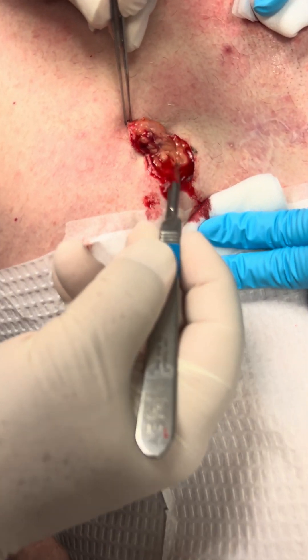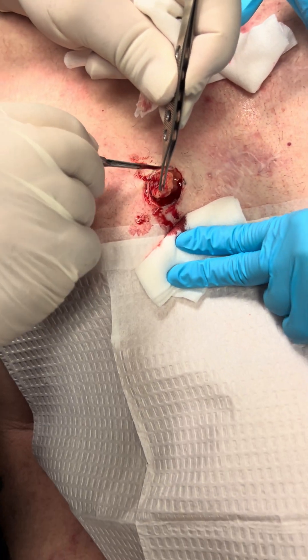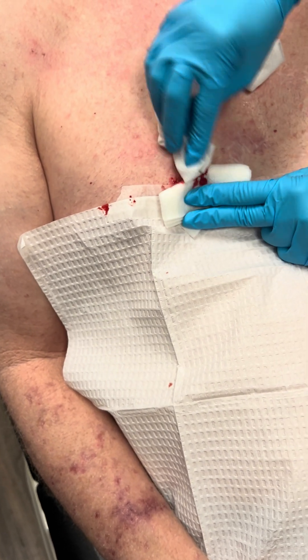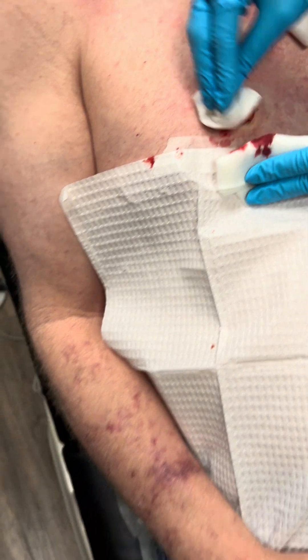See, there's the adipose right there. We have some here, so now we know we're underneath. Put this right here. Alright, let's take a look.